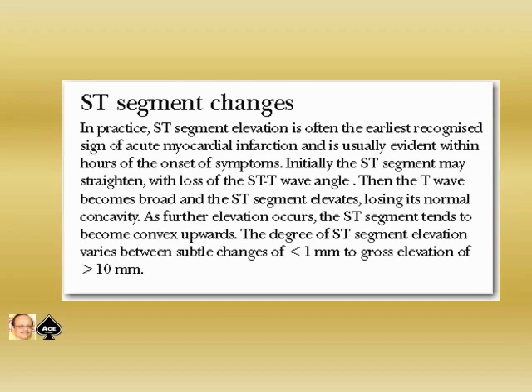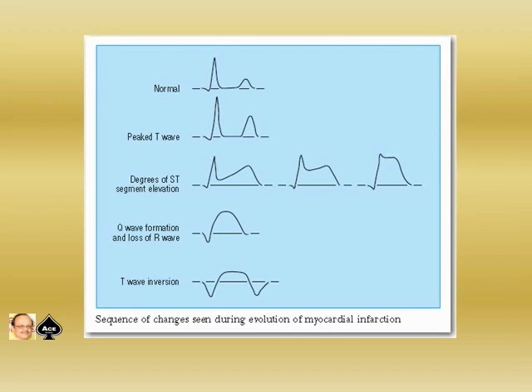The degree of ST segment elevation varies between subtle changes of less than 1 millimeter to gross elevation of more than 10 millimeters.